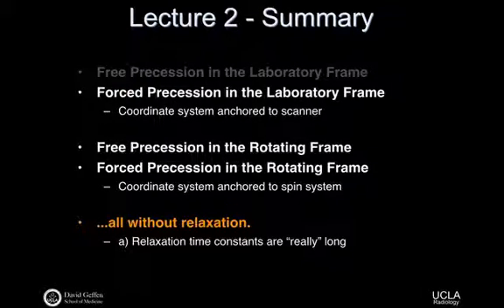So in the last lecture, we talked a bunch about free precession in the laboratory frame, and I said there were really 4 conditions that we care about preliminarily. Today, we'll talk about forced precession in the lab frame. That goes quickly, because we'll end up with a system of equations that's kind of complicated, and we'll say, you know what, let's try doing this a different way. And that encourages us to think about the rotating frame. And then today, we will work through free precession, writing out the expressions for free precession in the rotating frame and forced precession in the rotating frame. And again, this is all without relaxation. We haven't introduced that concept yet.